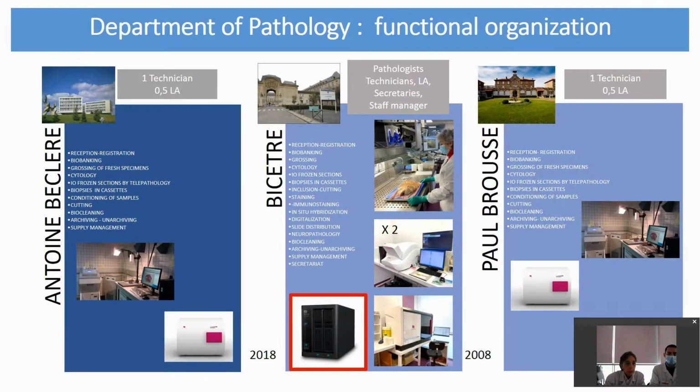A few words about the functional organization of the department. The technical platform and the medical staff are located in Bicêtre Hospital. In Paul Brousse and Antoine Béclère Hospitals, there is only one technician present on site, in charge of reception, registration, grossing of fresh specimens, biobanking, intraoperative frozen sections by telepathology, and cutting specimens for molecular pathology.